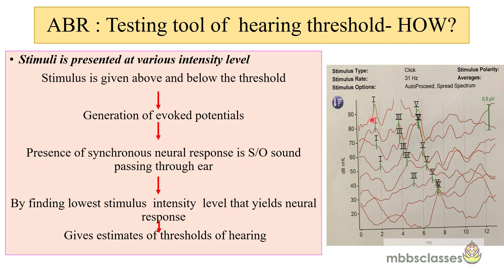There are five waveforms in an adult ABR when elicited by a click stimulus. Here you can see waveforms 1, 3, and 5. The starting intensity level used is 90 dBNHL. What we try to find out is the lowest intensity level at which we can still see wave 5. Here the lowest intensity where we can see wave 5 is 30 dBNHL, and this is how we assess the threshold of hearing.